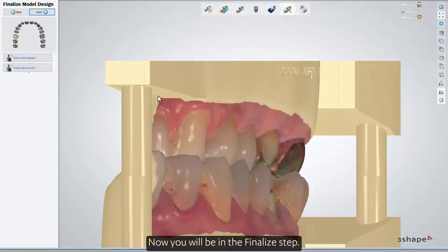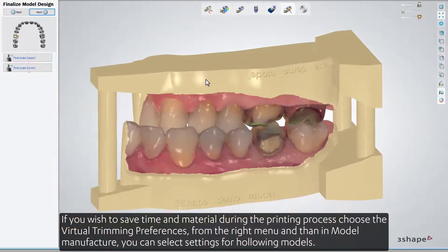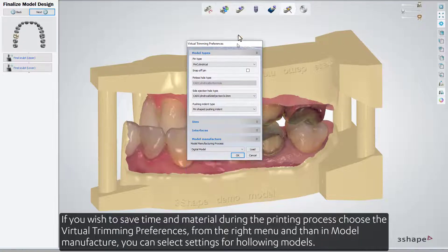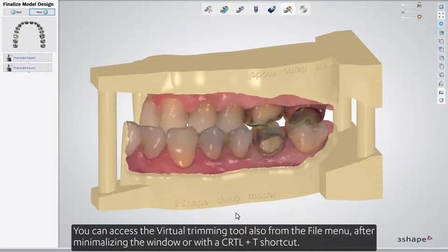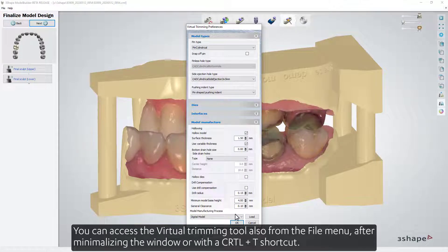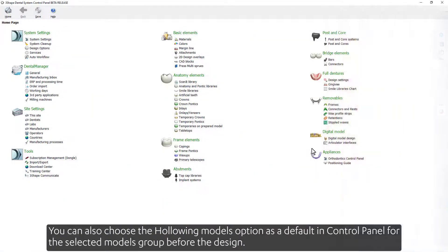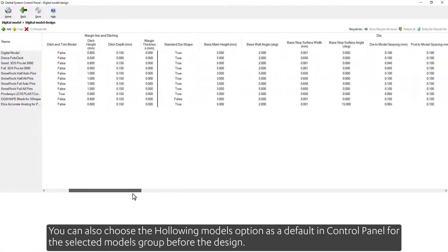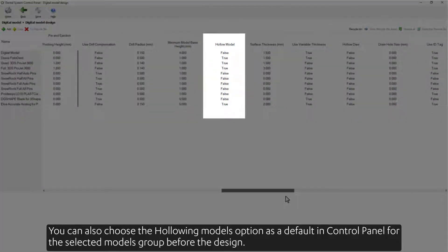Now you will be at the finalized step. If you wish to save time and material during the printing process, choose the Virtual Trimming Preferences from the right menu, and then in Model Manufacturer you can select the settings for hollowing the models. You can access the Virtual Trimming tool also from the File menu after minimizing the window, or with a Ctrl-T shortcut. You can also choose the Hollowing Models option as a default in Control Panel for the selected Models group, before the design.